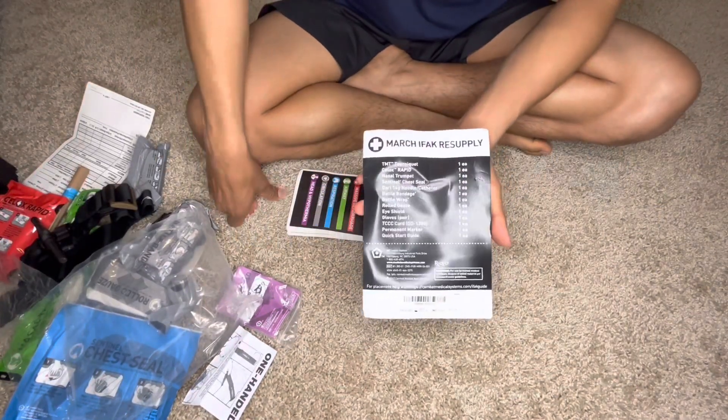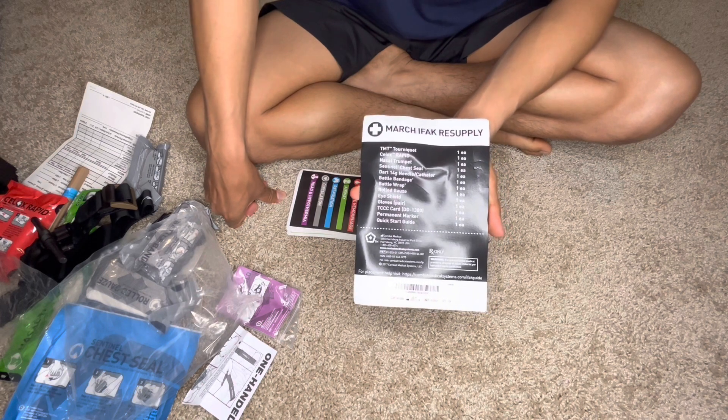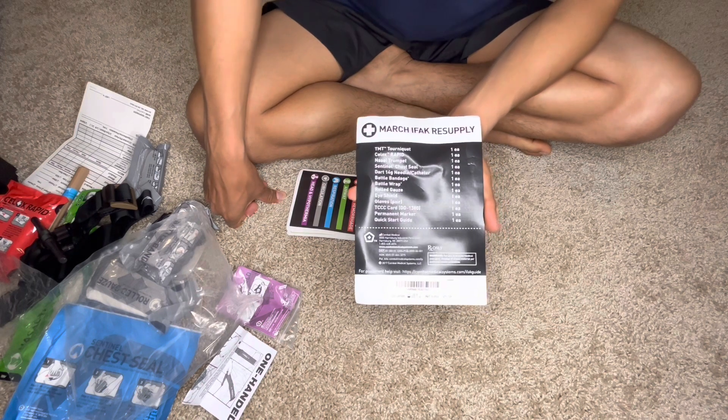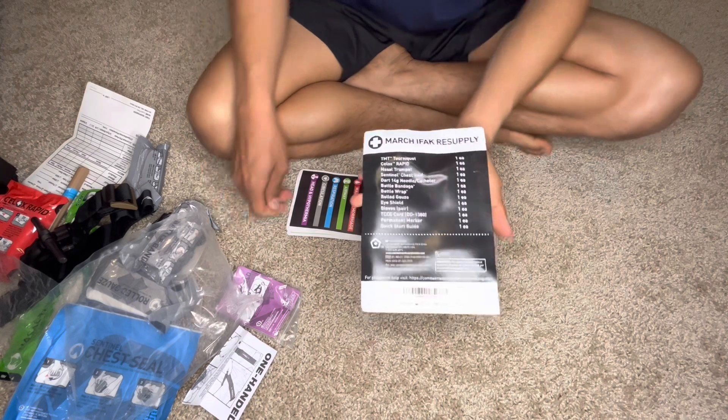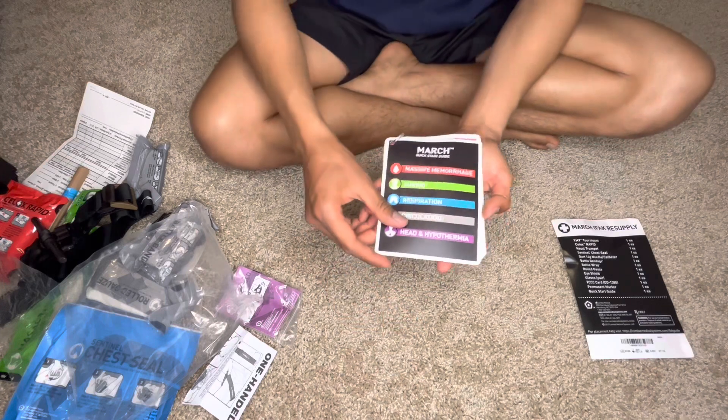Hey guys, I'm just going to show you what's inside the individual first aid kit that the military is currently using. We'll go over each item on the list and I will show you the actual item.